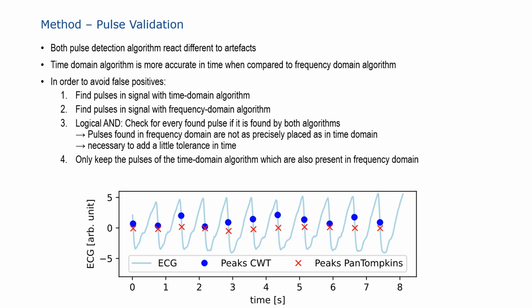This is like a logical AND function, but we had to take care of the small inaccuracy of the frequency domain algorithm. The peaks detected are usually a bit off, so that we have to add a small tolerance in time.